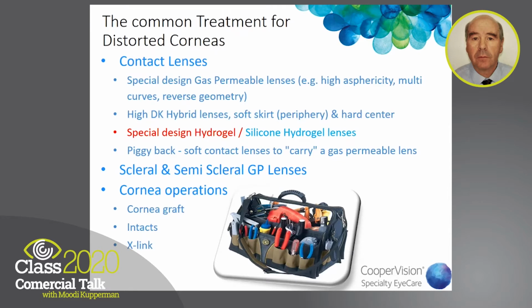Piggyback means that we have a soft contact lens, mainly a one day disposable silicone hydrogel lens, carry a gas permeable lens, so you have to replace the soft lens every day.